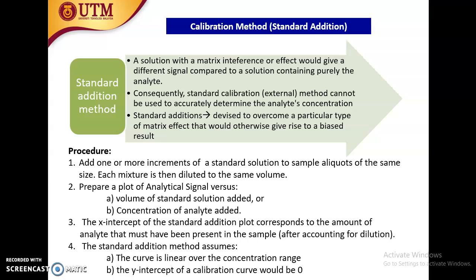If you are using spectroscopy method, we want to see how much of the matrix absorbs or emits the spectroscopy radiation. When you get signal in standard addition, it means that the signal is more reliable, more fair. It gives you data that is supposed to be inside the volumetric flask.